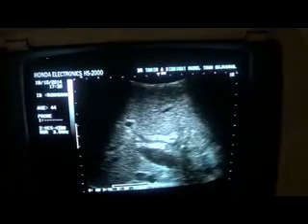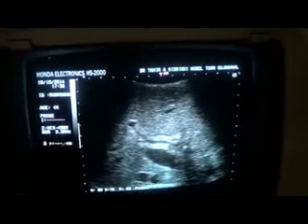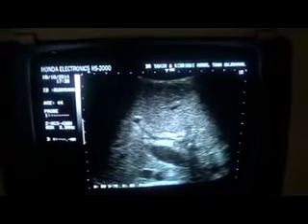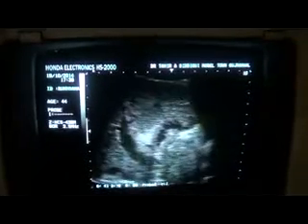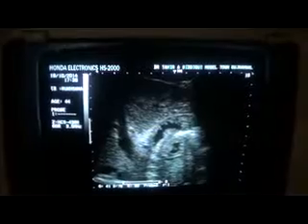This is the portal vein. This is the common bile duct, and see, this is the duodenum. In this region we see the gallbladder. It has been surgically removed because of some procedure on the pancreas.